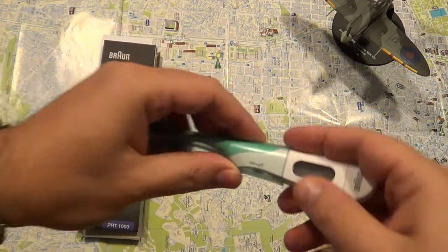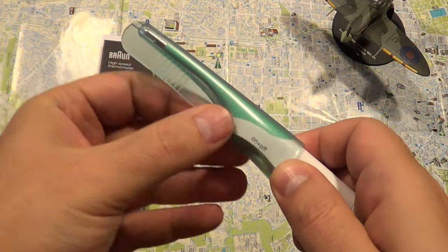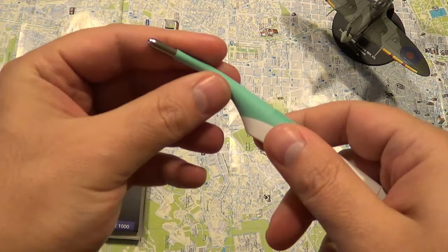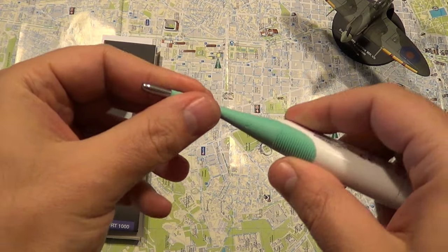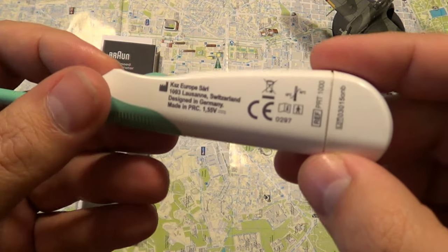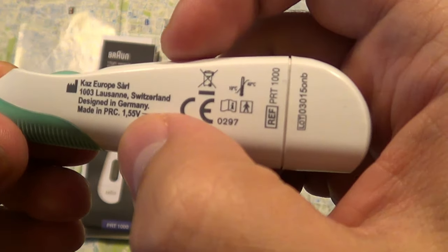So let's see what it looks like. It's plastic of course, it has a casing, and what's a bit peculiar is the fact that this tip here, this edge, is flexible. It will take a 1.55-volt battery.